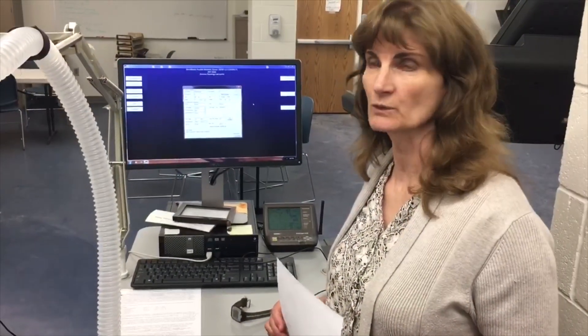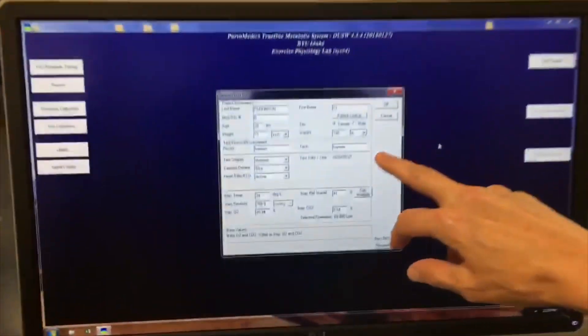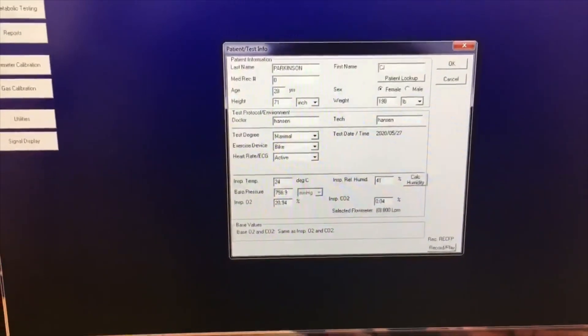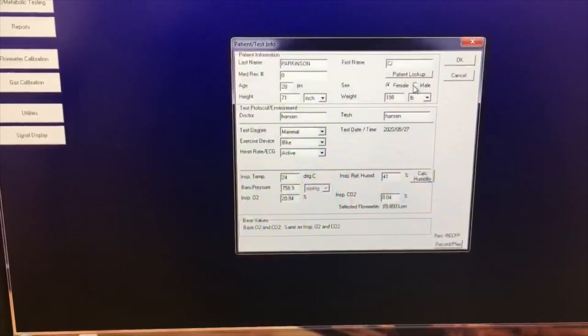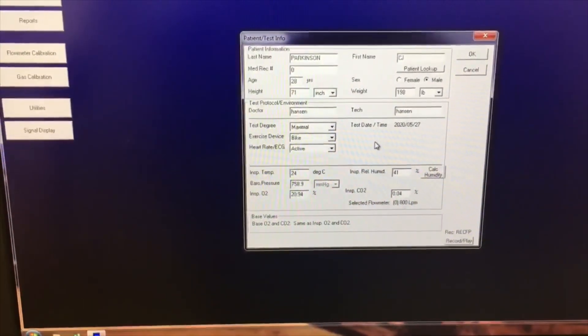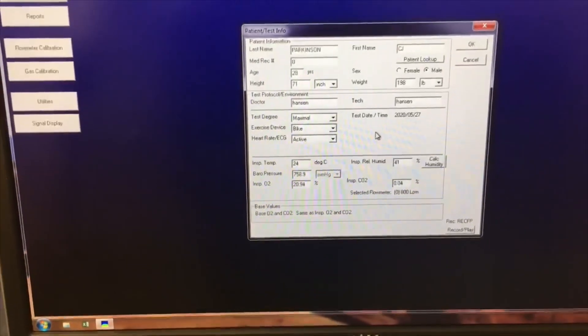As you can see on the screen, we have entered the subject's name, age, height, and weight. We need to put on there that he is a male and that we're doing a bike test. We also put on the indoor temperature, humidity, and barometric pressure.